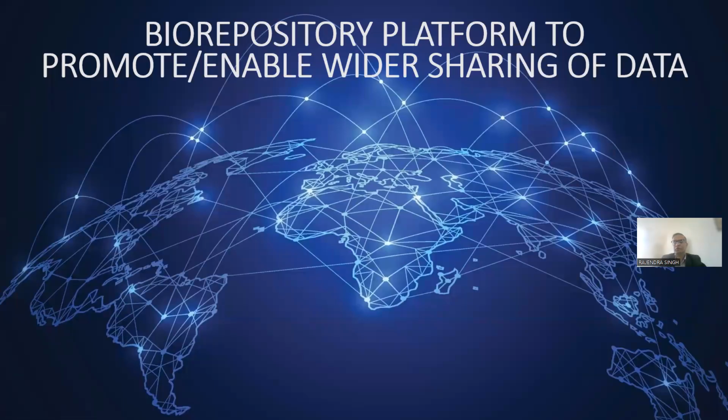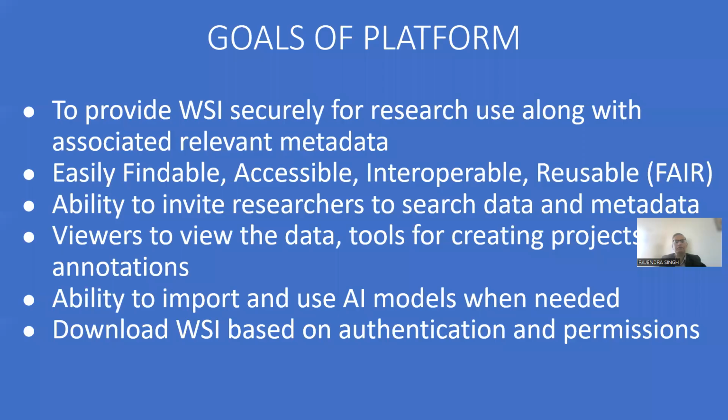Hi, I'm going to give you a walkthrough of the platform that we have created to help biorepositories promote and enable the wider sharing of data for research. The goals of building the platform were to provide biorepositories the ability to securely share whole slide images for research use, along with associated relevant metadata, making sure that the data is easily findable, accessible, interoperable, and reusable.